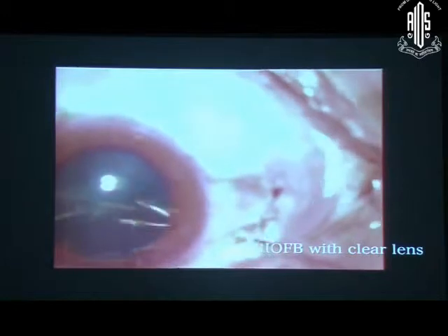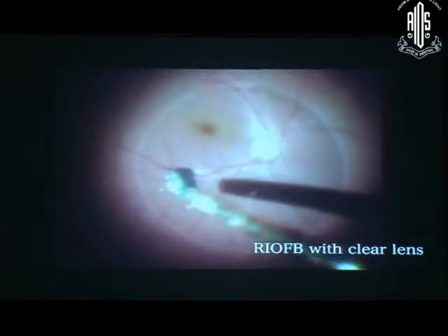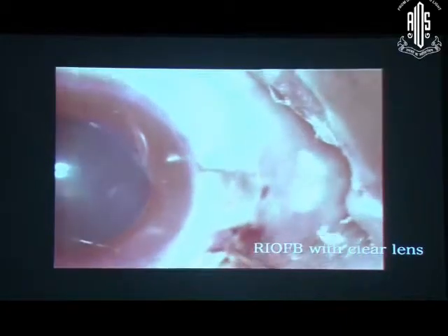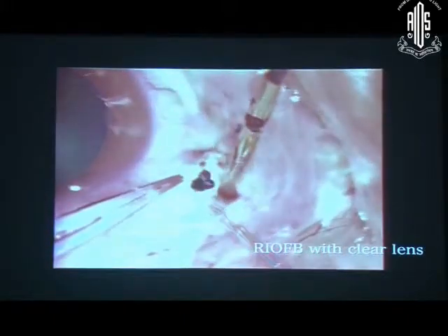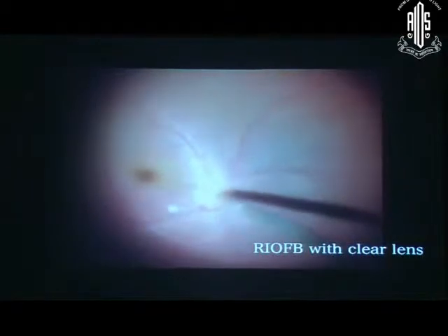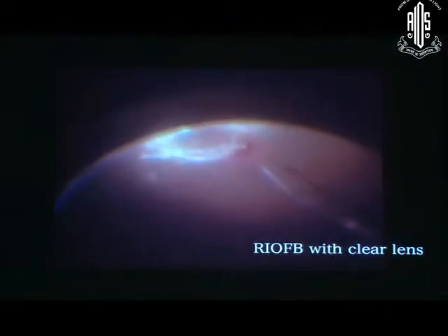Now again I am using another forceps by handshake technique, but sometimes this type of hiccup situation can happen — don't worry, you have injected PFCL. That is the role of PFCL: to provide protection over the macula and prevent damage to the macula. Now with the help of this magnet I am removing it. You should not hesitate to extend the scleral wound in 20 gauge cases.